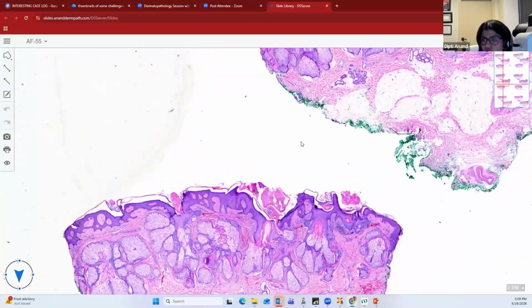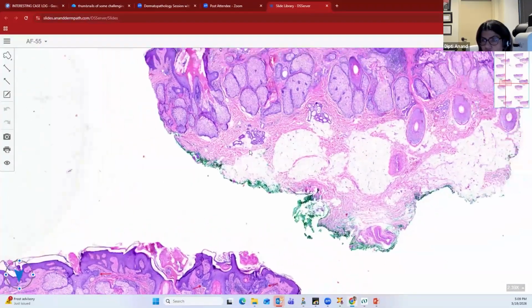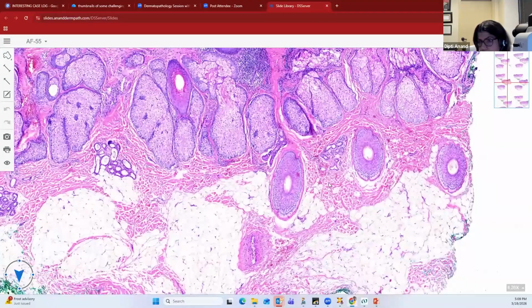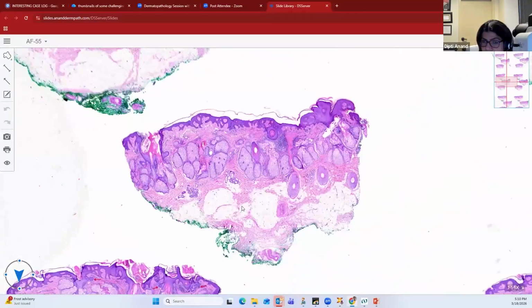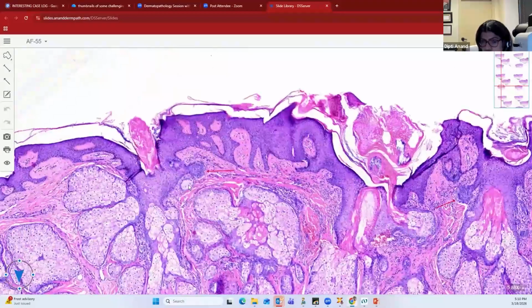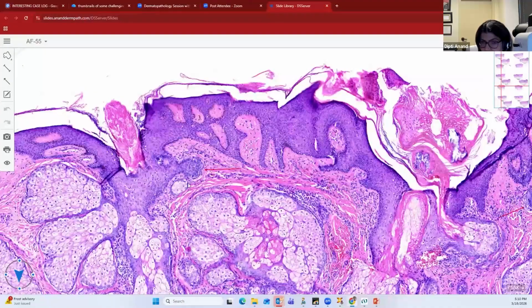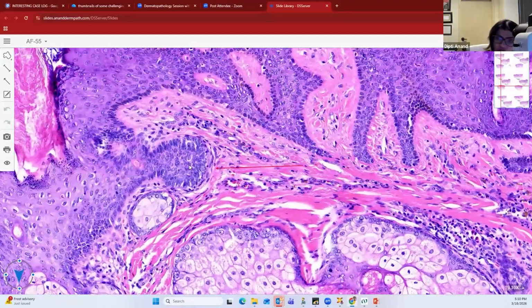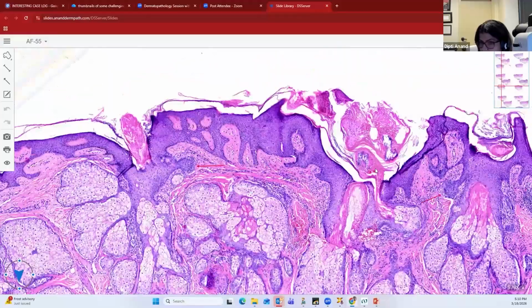So this is how the normal mature hair follicles on the scalp should look. You can see how these normal hair follicles are lying down deep in the fat, right? These will have the nice long hair shafts. So it is aborted. In nevus sebaceous, you do not have normal hair follicles. Instead, you have immature hair follicles. You can see this tiny baby immature hair follicle. This is the basaloid component of the hair follicle, which should actually be deep down in the fat, and it is tiny. So where is it going to form the hair shaft?